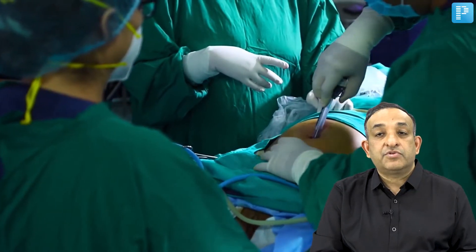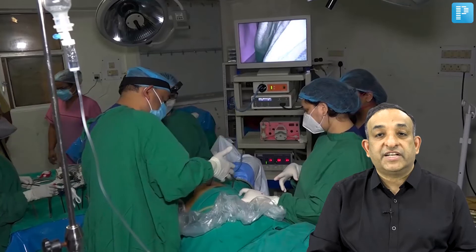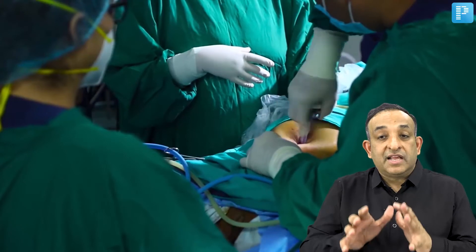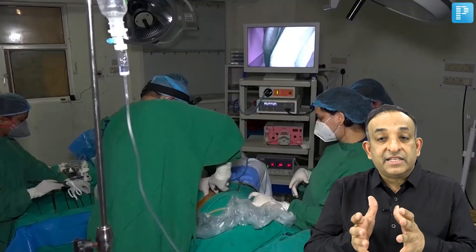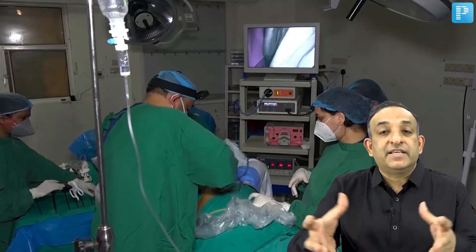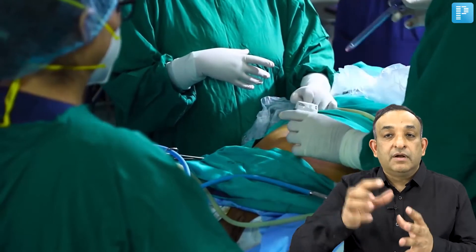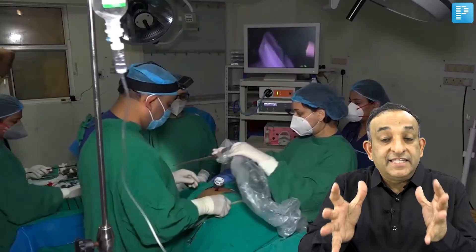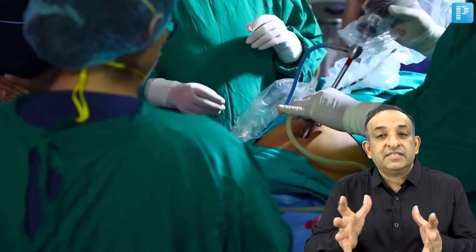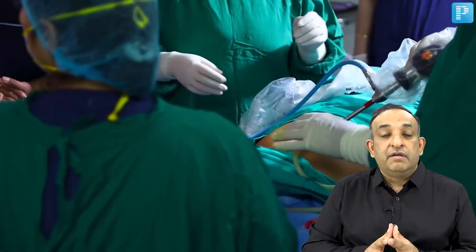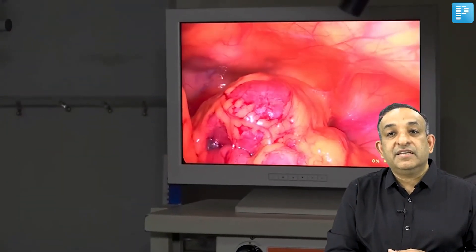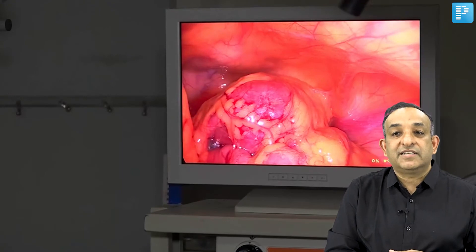I enter the abdomen in a corkscrew fashion, and I know I'm correctly placed because I can hear air hissing out from the open valve of the cannula. I then enter with the scope, which has been white-balanced already. The moment I enter the abdomen, I can see there are a whole lot of adhesions in this patient.